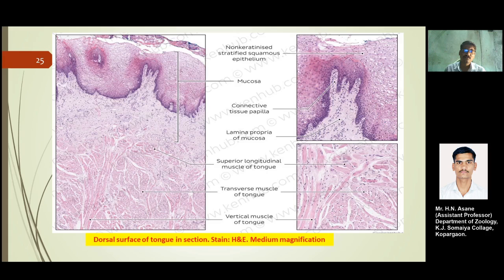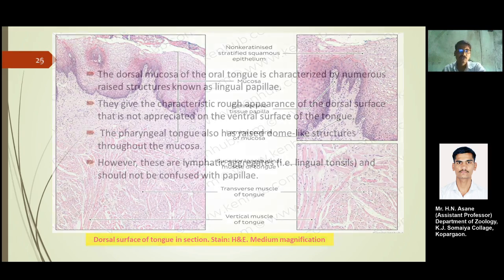These muscles produce the movements of the tongue within the buccal cavity as well as its modifications, giving smooth function, so they play important roles in the tongue surfaces.